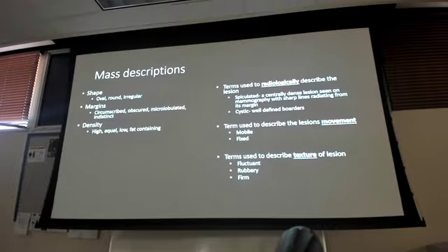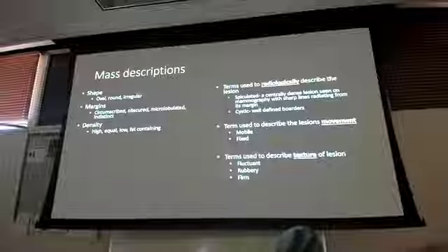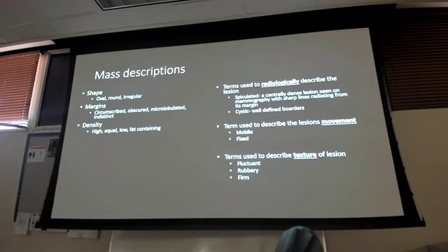so they make sure to get that area when they're doing their scan, right? These don't have a general area where they're usually in, they can be anywhere within that tissue. Anywhere in the breast tissue, including up in the axilla and the tail of the breast, where a lot of people often kind of forget to do their physical exam and palpation, which you guys will learn in senior semester. But yeah, they can be anywhere where there's breast tissue, males or females, right? Males or females.